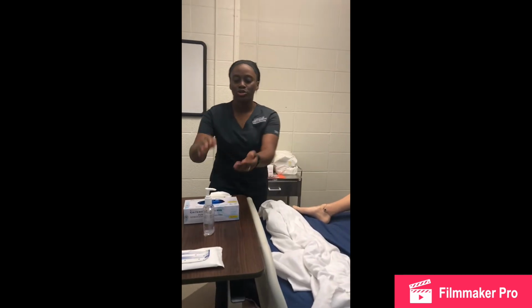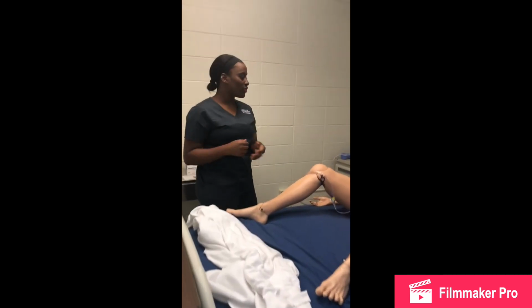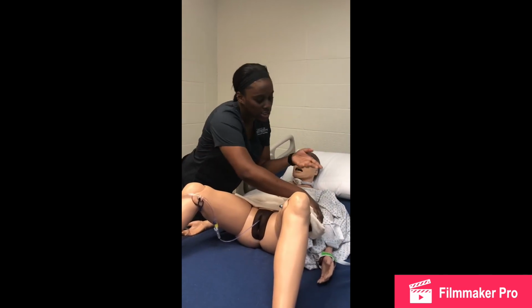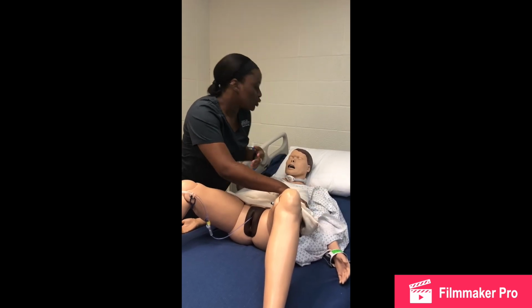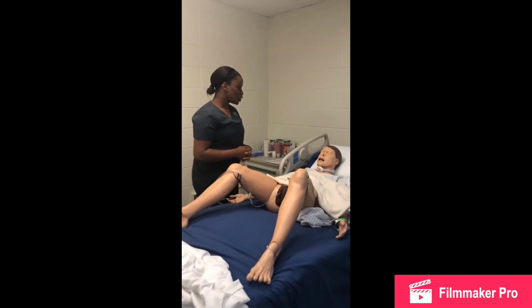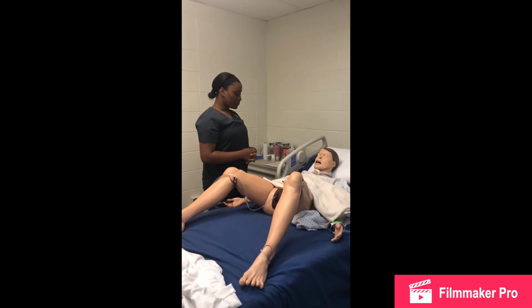So before I enter my patient's room, I'll wash my hands. Make sure I create privacy for my patient. Then I'm going to introduce myself to my patient, check his name and his date of birth, or in this case, her name and her date of birth, to make sure I have the right patient. Make sure she verbally tells me her name and date of birth as well. Then I will tell her my name. I'm Ushin Walker, your nursing student, and I'm here today to remove your Foley catheter.